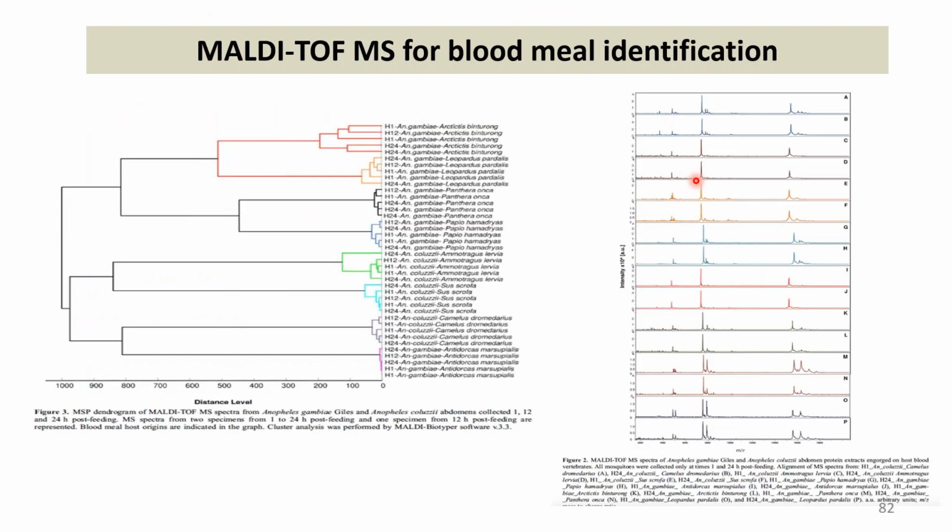And so we added more, sometimes quite exotic species. Although you could think that those are really similar, they are actually quite specific to the blood source, especially in the first peaks here. This is where you would see most of the modifications.